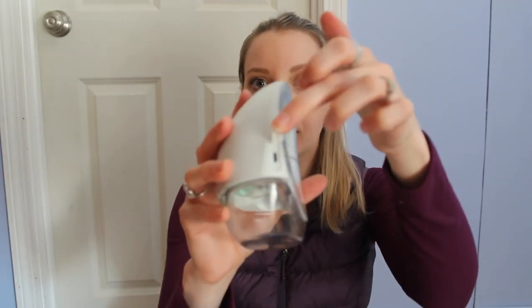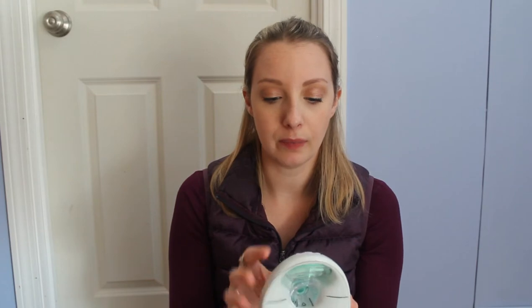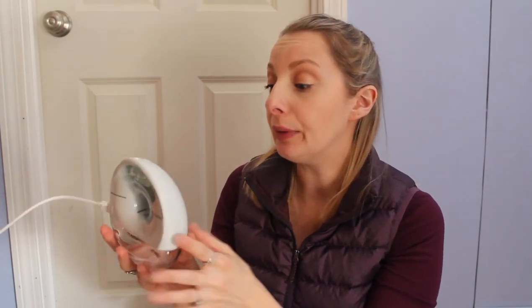I wonder what this little button is here. Oh wait — this is the charging port! Love that. So the charging port is right on the corner there, and there's a little protective cover. I do want to see if this has any charge. Doesn't look like it. There's actually an outlet right next to me, so I'm going to plug it in and see if we can hear what it sounds like. The cord is a little bit short. There is a little light — I can see it's red on top to let you know that it's charging. Love that.